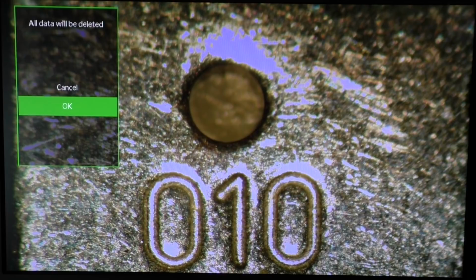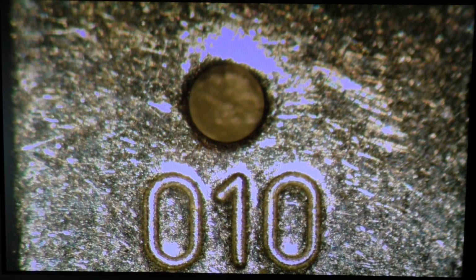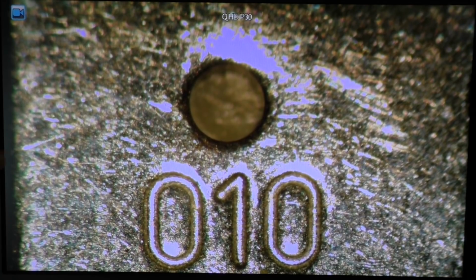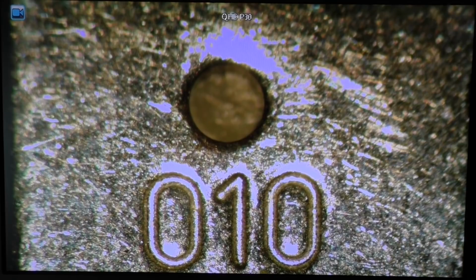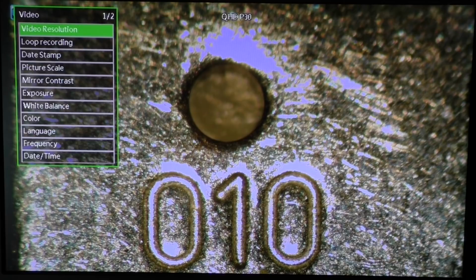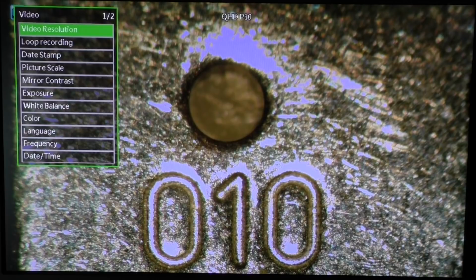Okay. Well, maybe it has formatted, maybe not. Then we leave the menu, we press the mode button. There is a mode button on the remote control and also on the camera itself. And you see the little symbol here. We are now in video mode, and if we press the menu, we get the video menu.